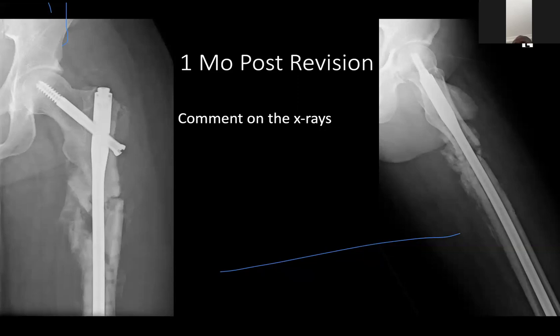I think you would also... Would the reamings be...? Brian, can you go ahead? So I think when you're doing the operation, it will help that when you're reaming, you keep the reamings and then use them as the bone graft. And it will also help to do a dynamic locking rather than a static locking. Yes, I think the reaming product. You put your hand up.